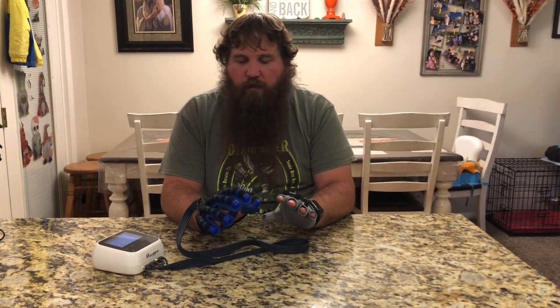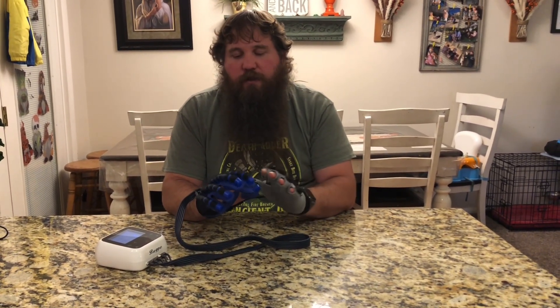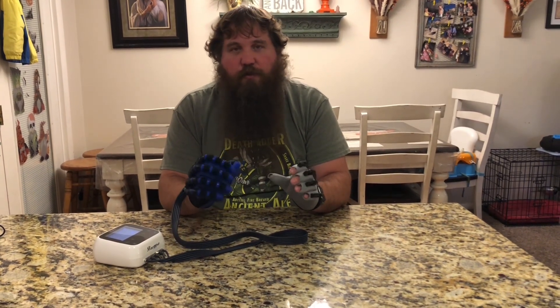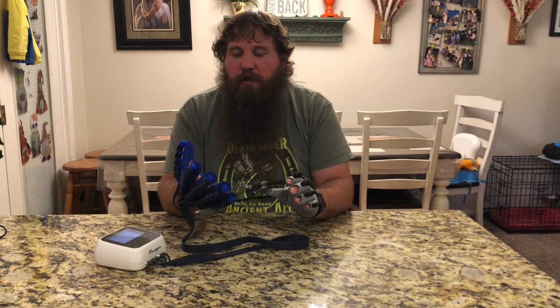This robot rehabilitation glove is gonna be really handy for somebody that's had a stroke, has some atrophy in their muscles, or is losing muscle capability in one of their hands. It's going to help retrain that hand and get the muscles back up. It is really soft — it doesn't hurt at all, it just helps move your hand for you. I'd highly recommend it, especially if you've had a stroke and need to get the use of your hand back. It's going to help make that process easier, smoother, and even faster — it's a really nice rehabilitation glove.